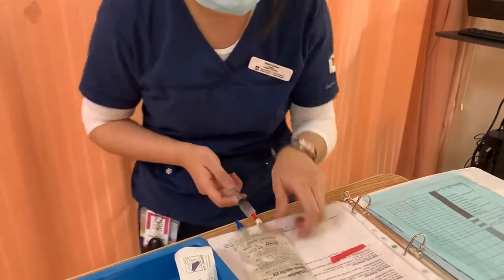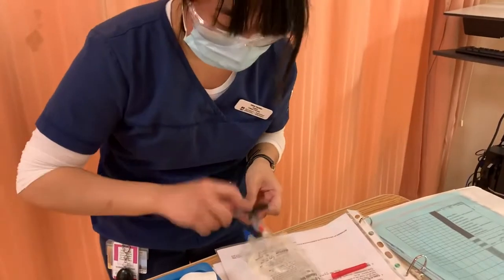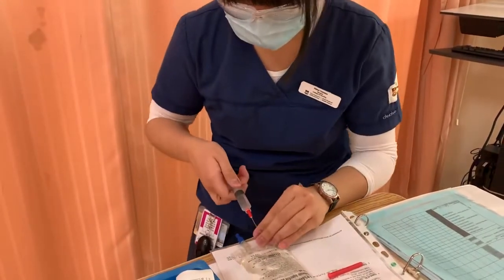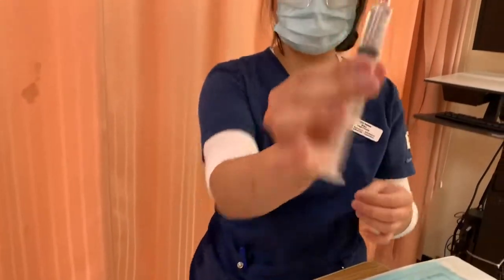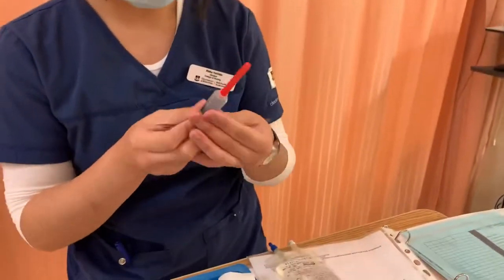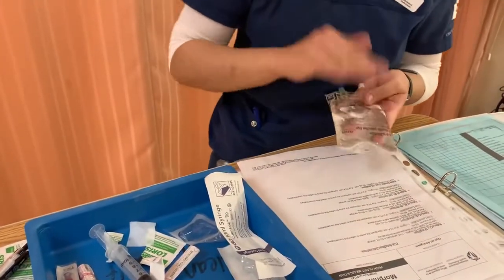I also checked my patient's vital signs prior so that I'll know that it is appropriate to give this medication to them, and their pain level as well. So I got my 5 mLs right there. So we're good. I don't see any air bubbles, so we're good. And that means we have 45 mLs in here, which is exactly what we need.